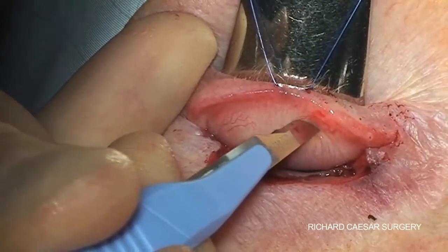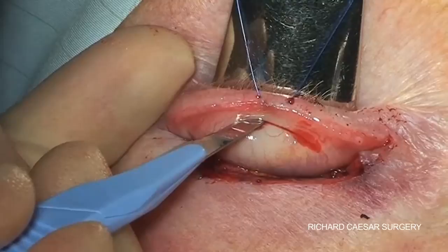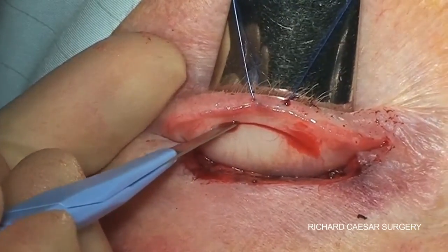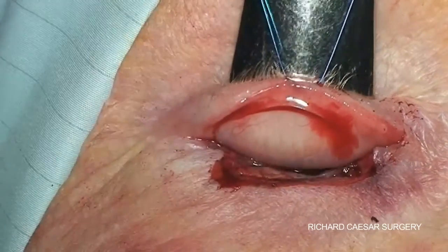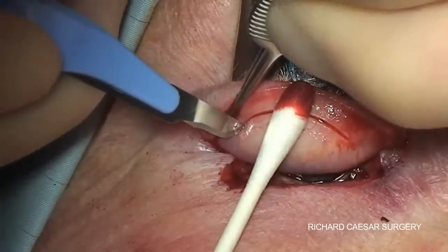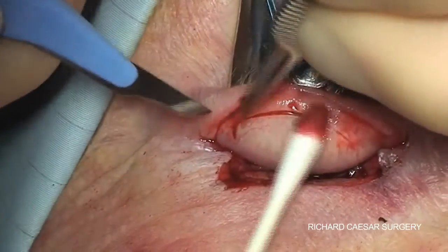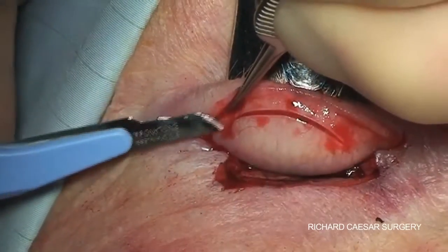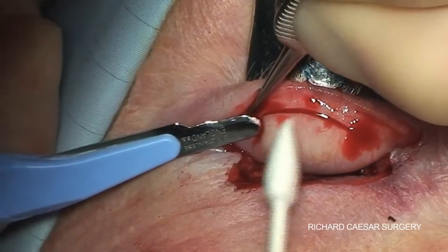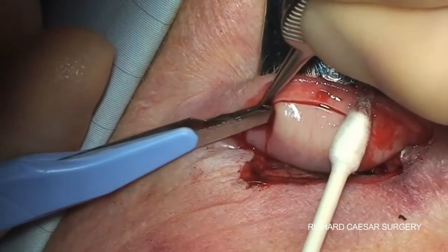You then cut through the tarsal plate, trying to cut just full thickness from one edge to the other, depending on the size you need. Then make a vertical cut into the conjunctiva. At this point it's worth tucking the blade in and making a little pocket here to be sure you are absolutely through the tarsal plate.